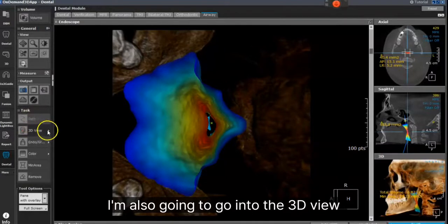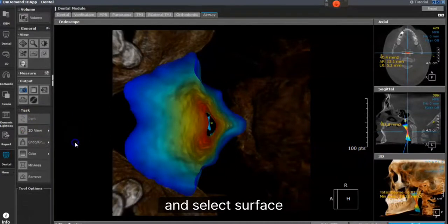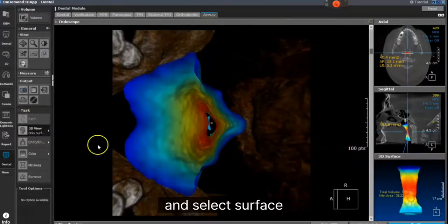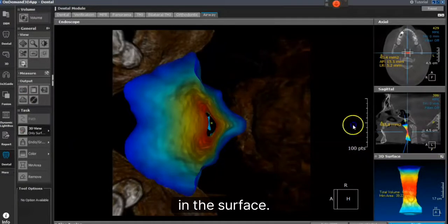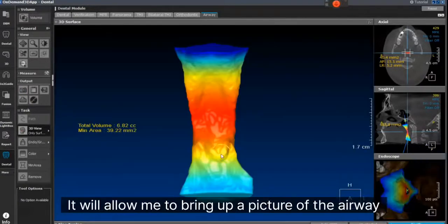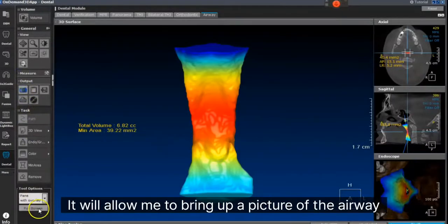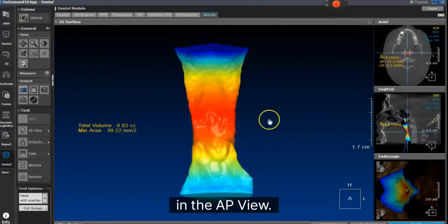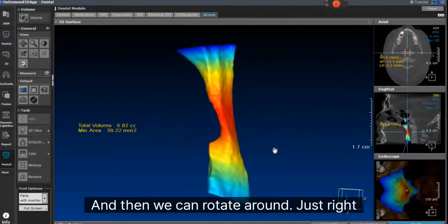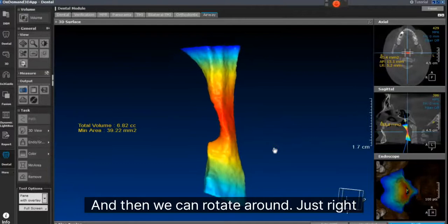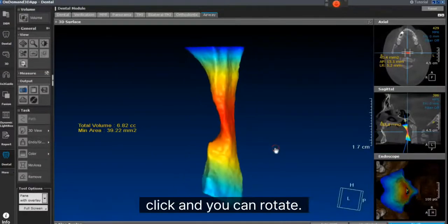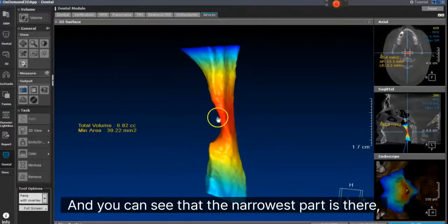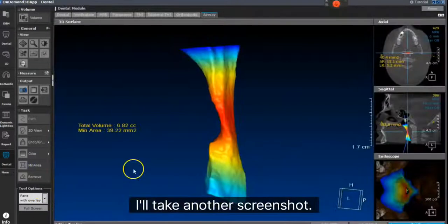I'm also going to go into the 3D view and select Surface. What it does in the surface view is allow me to bring up a picture of the airway in the AP view, and then we can rotate it around. I just right-click and rotate, and you can see that the narrowest part is there. I'll take another screenshot.